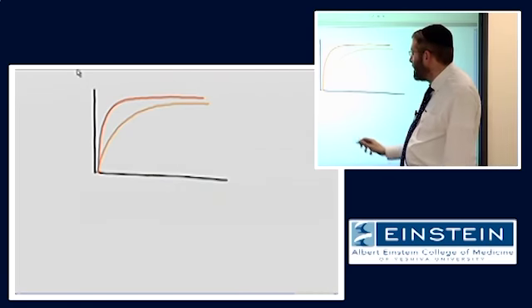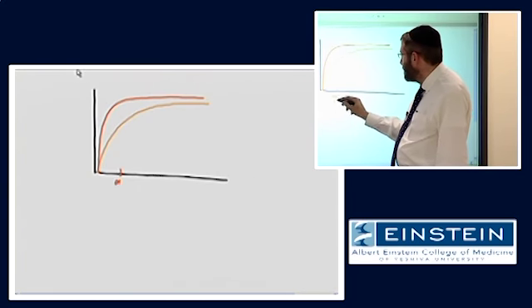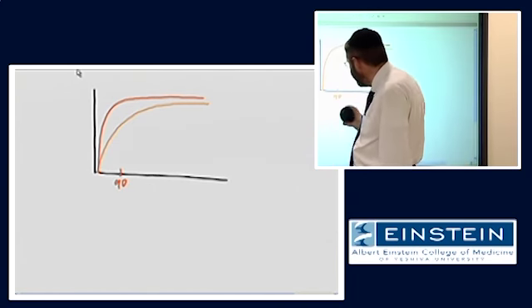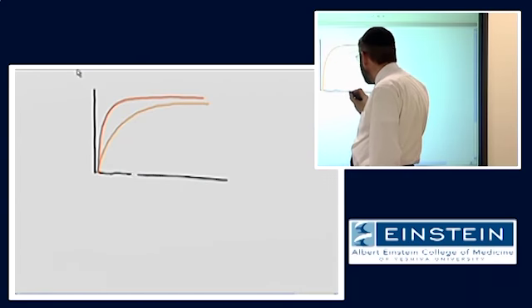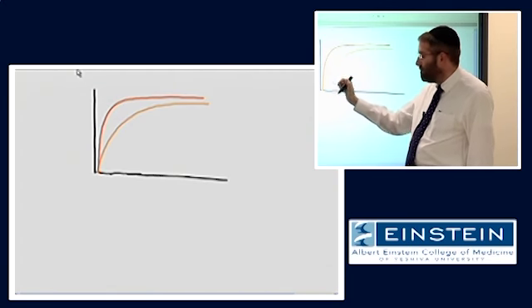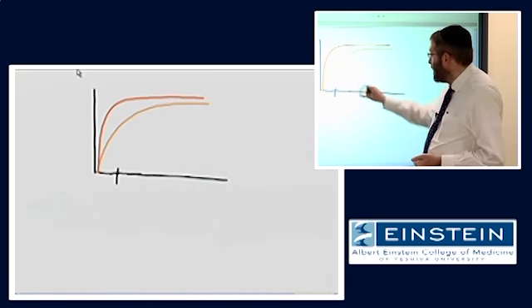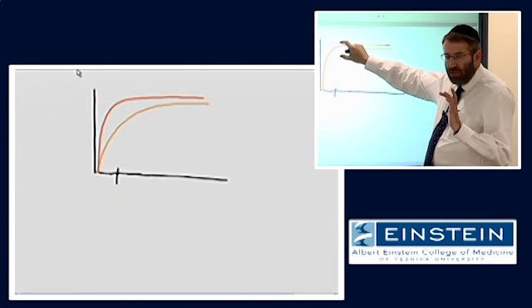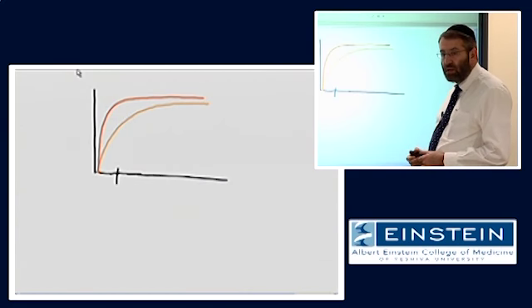So if we choose our TR, in this case, we could choose some TR at this point so that we were always repeating this at a point where we had a maximal difference between longitudinal magnetization and therefore signal of these two, and that would give us a T1 weighted image.